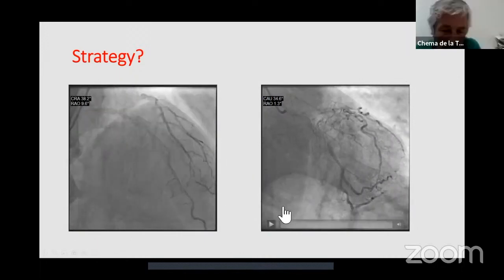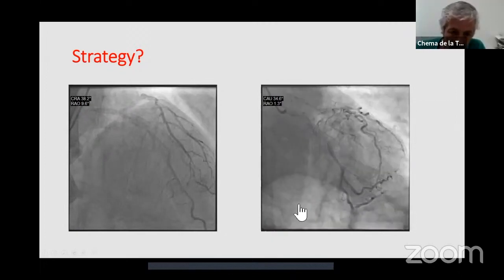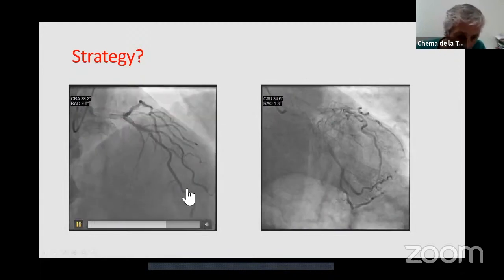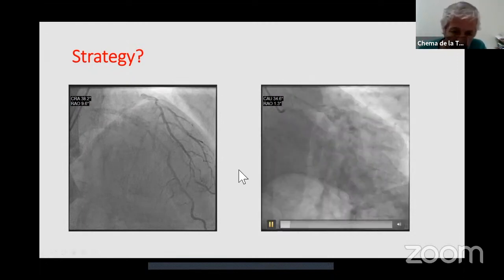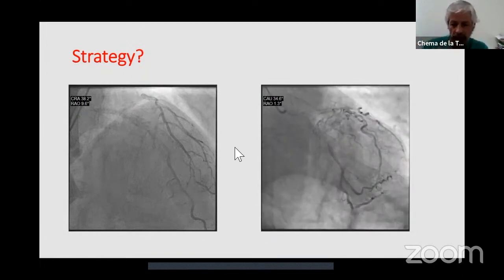Yeah, I am trying to figure out with angiography if the ostia of LAD and CIRC are involved. It looks like the ostium of the CIRC is more diseased, more affected than the LAD ostium. In the projections, the disease is in the distal left main, but the ostial LAD, of course, LAD is a bigger, important vessel, but the CIRC is not really a small vessel. And I think we need some imaging to see what's going on with the ostia of CIRC and LAD, because if one of them is well preserved, we should go with provisional to LAD or CIRC.